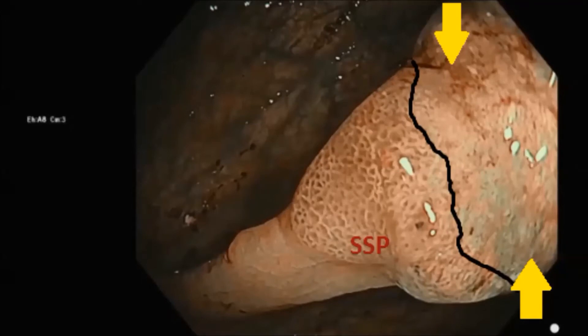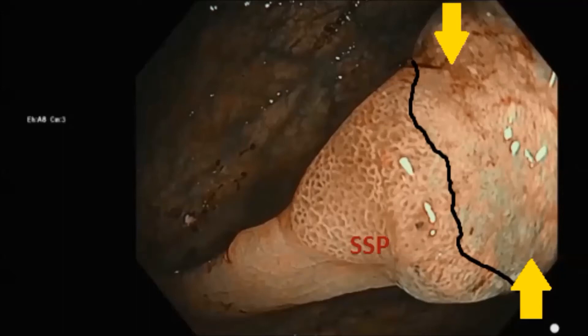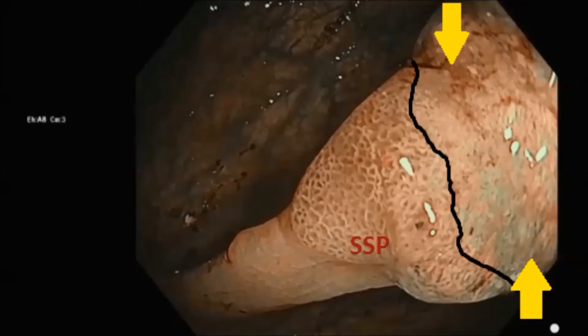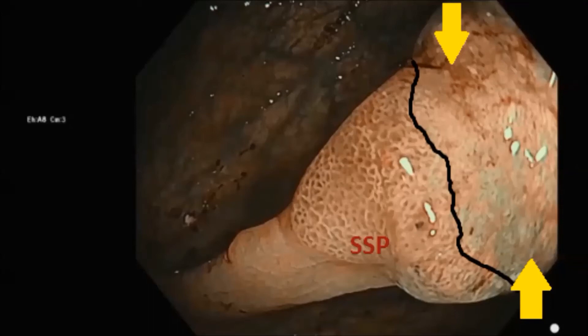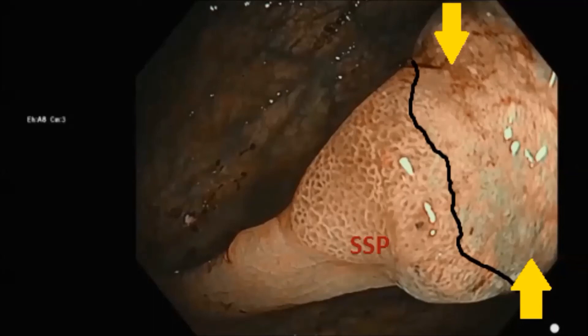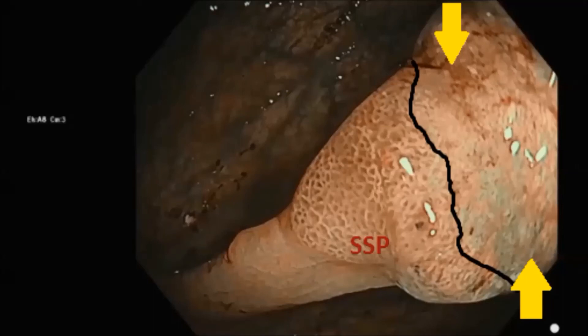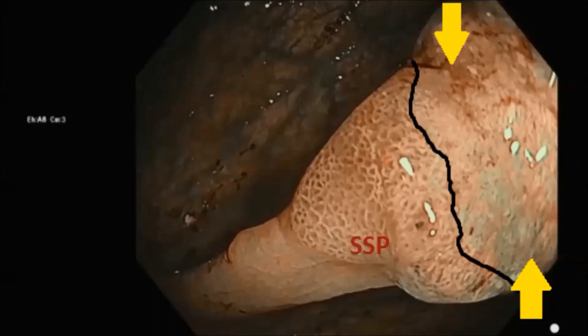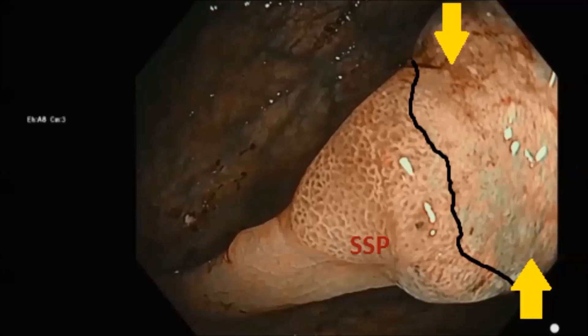In the still photograph from this case, we can see the residual SSP to the left of the black line — no areas of cytological dysplasia, very few blood vessels, large open black pits, typical SSP without cytological dysplasia. To the right of the line, there is ulceration — the area marked in yellow — which is cancer invasive into at least the deep submucosa. These videos and photographs demonstrate how we can endoscopically recognize the different stages of the sessile serrated polyp to cancer sequence, and it is very valuable to remain cognizant of this sequence as we search carefully for serrated lesions and attempt to interrupt and prevent this progression to cancer.